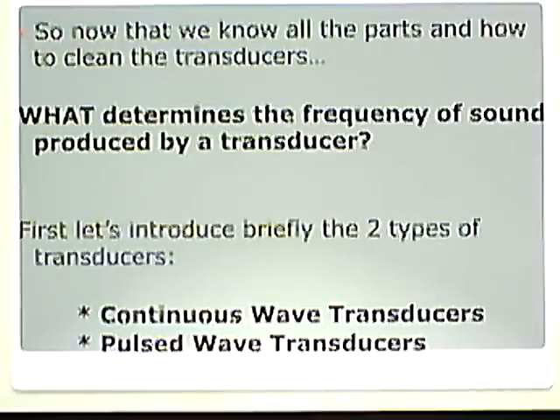So let's first briefly introduce the two types of transducers. Remember, we learned this earlier in Chapter 9. There are continuous wave transducers, and there are pulsed wave transducers. And we talked about continuous wave versus pulsed wave as far back as, I think, Chapter 2, which introduced that.